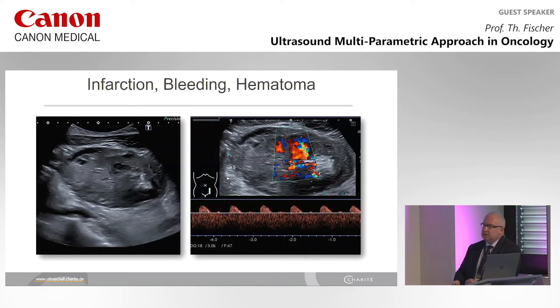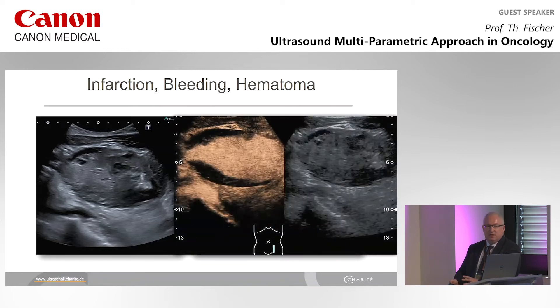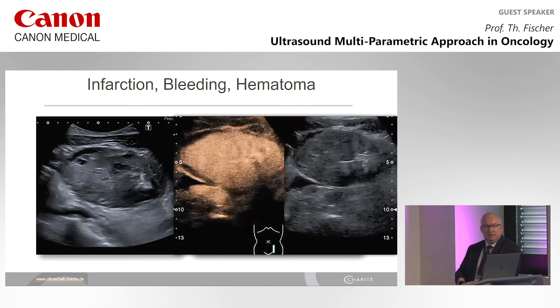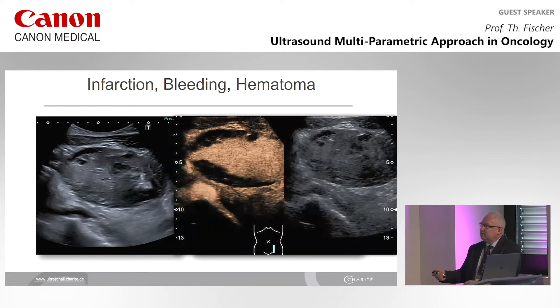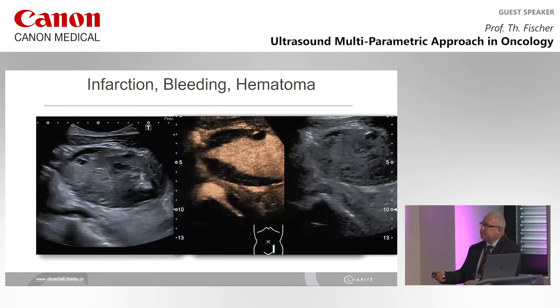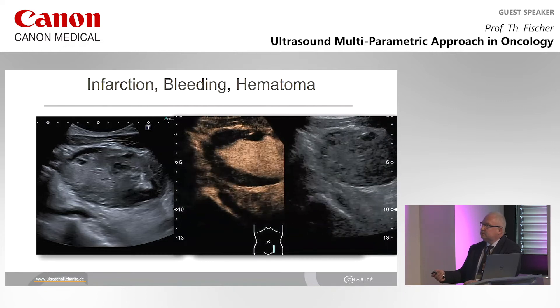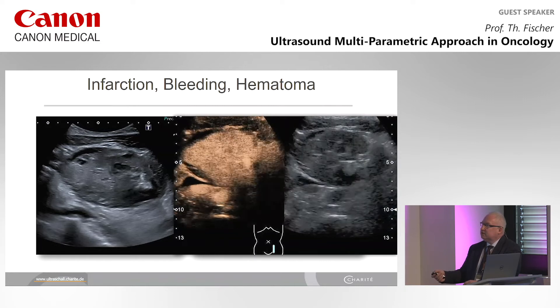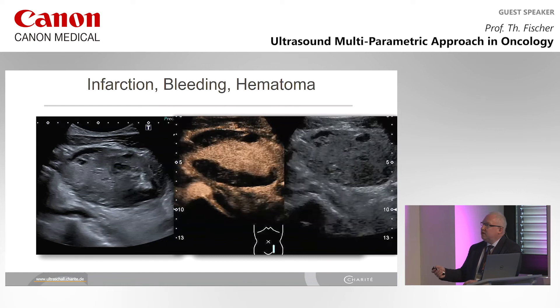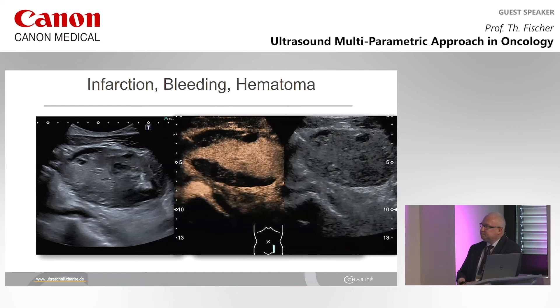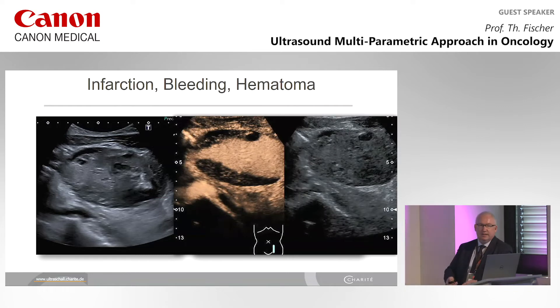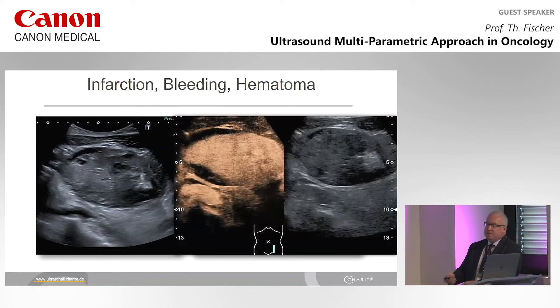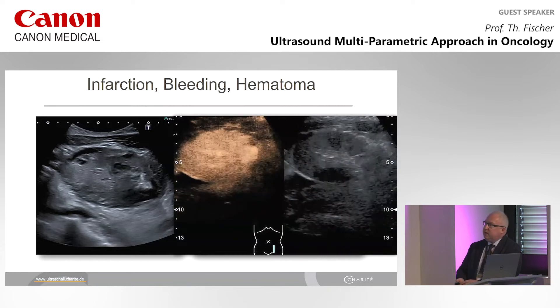Infarction, bleeding, and hematoma — look at this. This is conventional ultrasound, and now everything together. We can have four different diagnoses in one situation — it takes two minutes. Hematoma, active bleeding, and there was also one AV fistula visible at the beginning of this clip. We are very fast to get in touch with the right diagnosis, and this patient underwent immediately to the operating theater. We can save the life of the kidney graft.